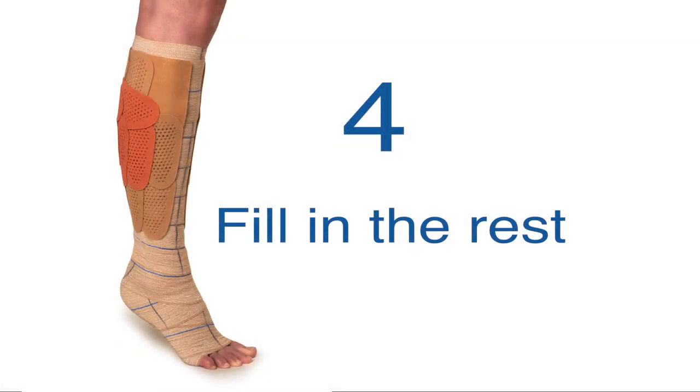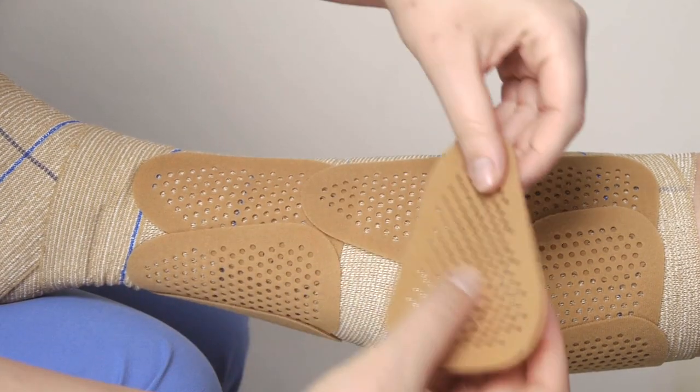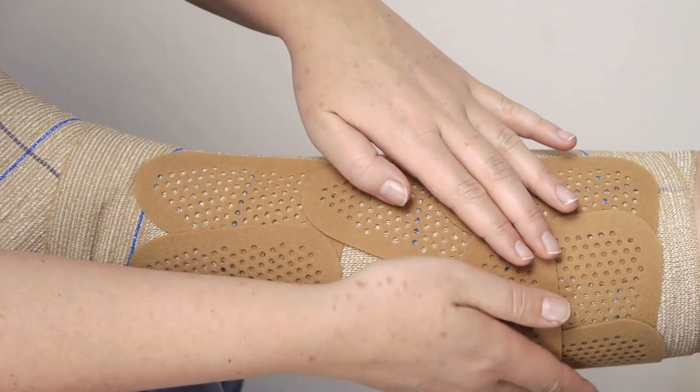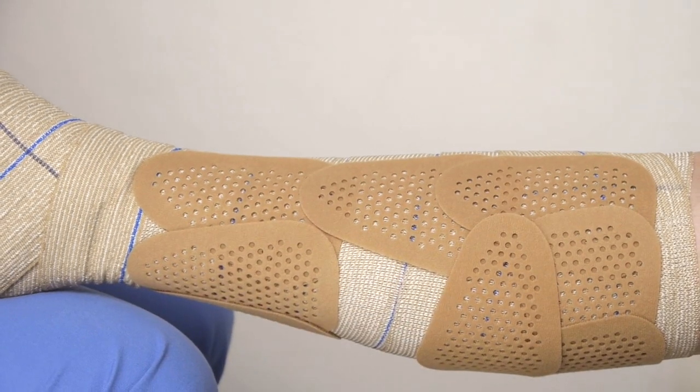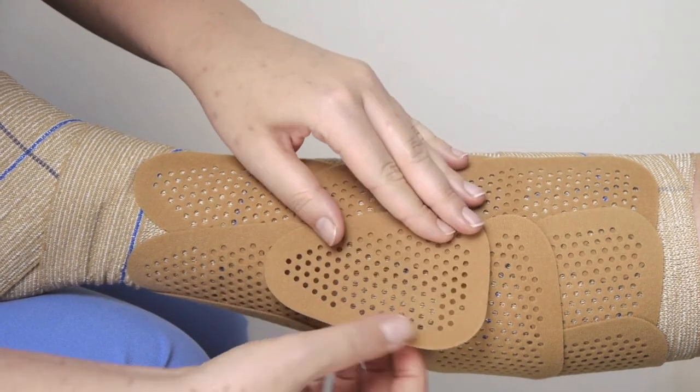Now cover the rest of the leg with patches. When covering the rest of the leg, the patches can be placed in any direction. Use the shape of the patches to follow the shape of the leg, and remember to stretch the patches slightly for a close fit.